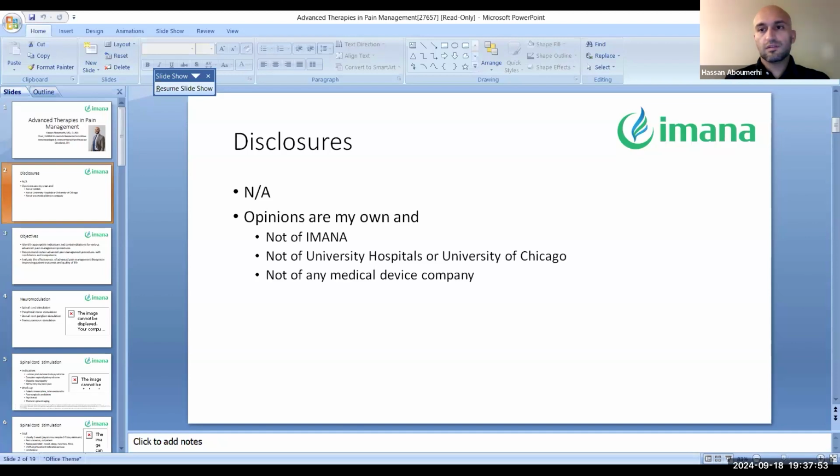The limitations of the trial, anyway, especially confounding soreness. You really want them to maintain some movement restrictions so those leads don't move out of place, so you can get a false negative, right? Because the leads have moved away from the target area of the spinal cord that we're trying to stimulate. And also they can't submerge underwater or get that area wet. So we talk about sponge bathing or using a detachable shower head to basically wash their lower body.